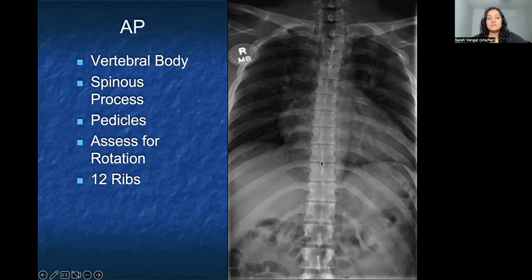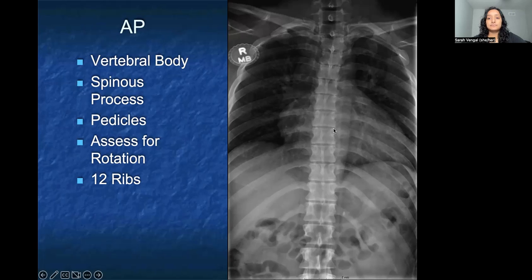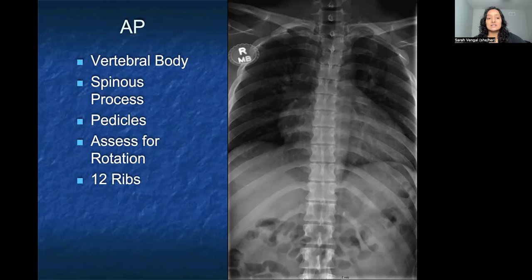We'll be using these landmarks of the spinous process and the pedicles. You can also assess for rotation — whether or not the patient is turned to the left or the right — to help determine if you're looking at the patient straight on and whether that is affecting the uniformity of the vertebrae. In the thoracic spine, patients also have 12 ribs, so you can count those ribs to assure that there are actually 12 of them correlating with each thoracic spine level.